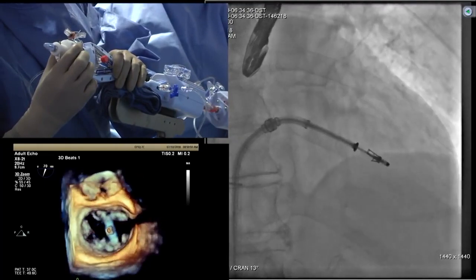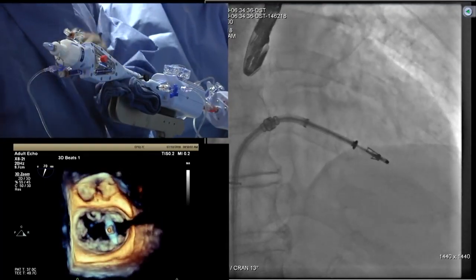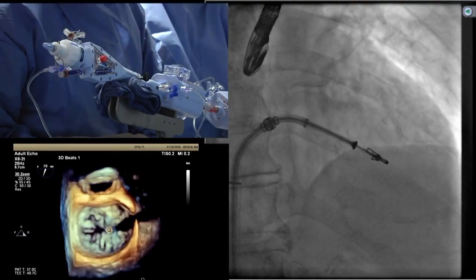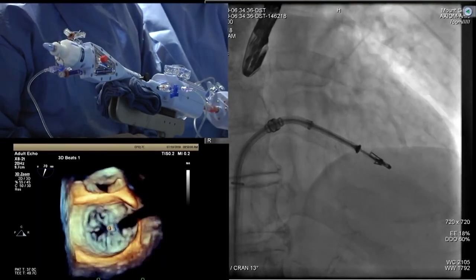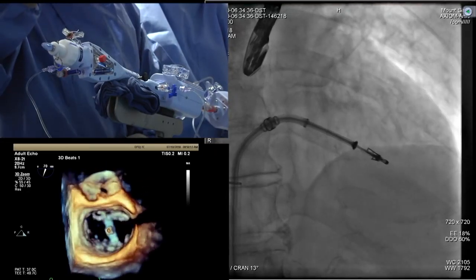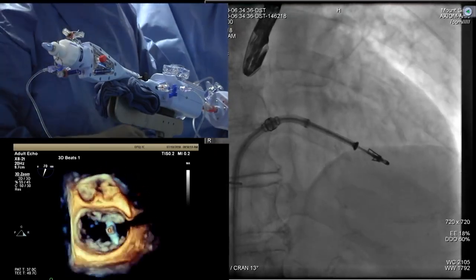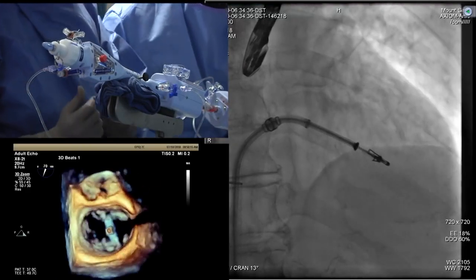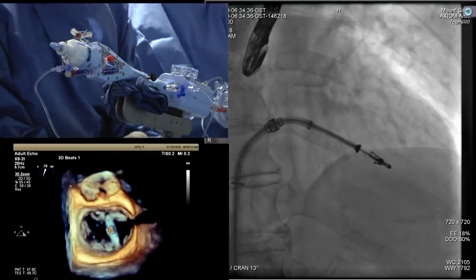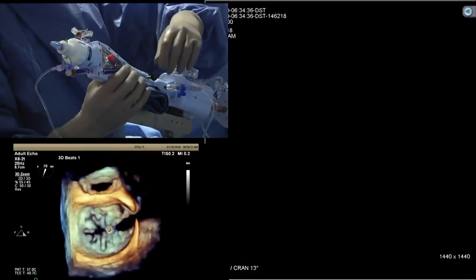So one great thing about this XT system, like you see here, is since the clip is 3 millimeters longer, as soon as we go in, look, the leaflets are already there, compared to the old system where we had to do a lot of movements. The orientation? You need to rotate clockwise, just a tiny bit.